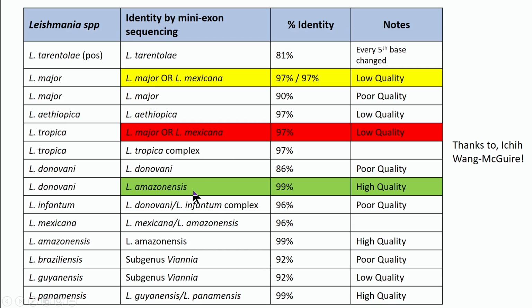But ATCC performs a really incredibly valuable task, but bless their hearts, they handle a huge number of strains, and getting a strain that is misannotated from them is not unheard of. Nor is getting a mycoplasma contaminated cell culture strain or a HeLa cell contaminated strain. It's a big problem starting in the 1960s. So I think what we've done actually is just found an error in ATCC's catalog that we can now correct, and that proves the point that I think this assay is working, or will be working soon.